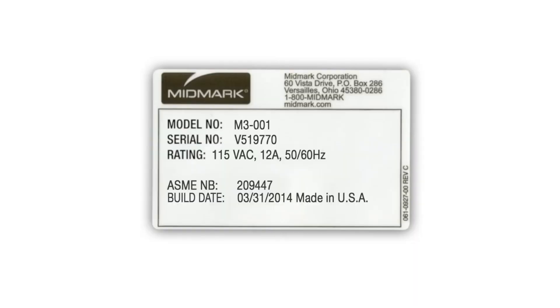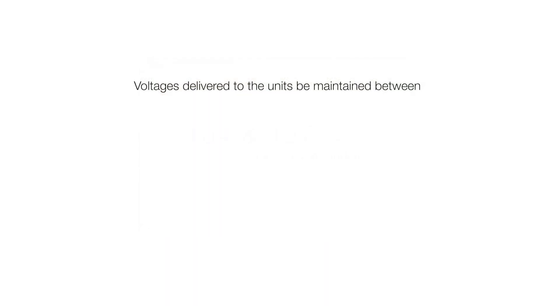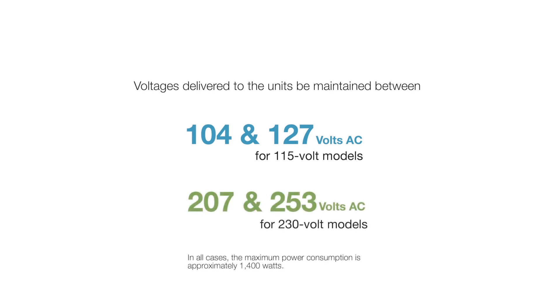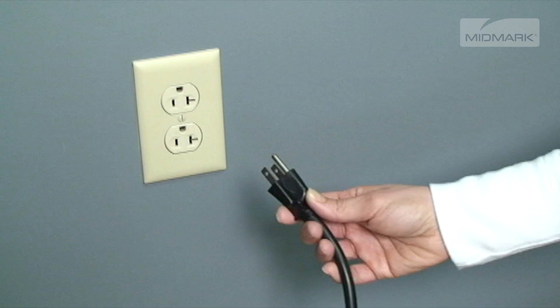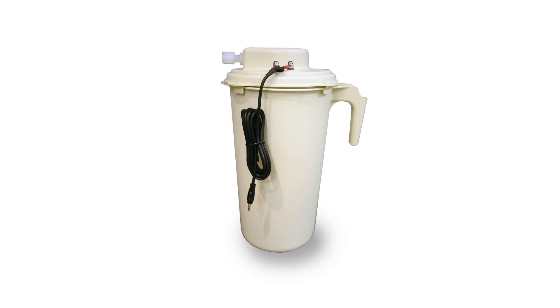Failure to do so can result in damage. The M3 is available in either 115-volt or 230-volt AC configurations. It's critical that the voltages delivered to the unit be maintained between 104 and 127 volts AC for 115-volt models, and between 207 and 253 volts AC for the 230-volt models. In all cases, the maximum power consumption is approximately 1400 watts. The autoclave requires a dedicated electrical circuit and should not be connected to an electrical circuit with other appliances. In all cases, it's necessary to use a three-prong, grounded unit. To ensure the unit is properly grounded, it must be connected to a matching grounded and correctly polarized receptacle.